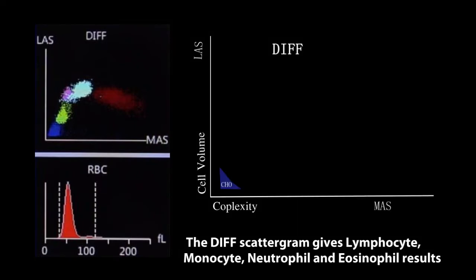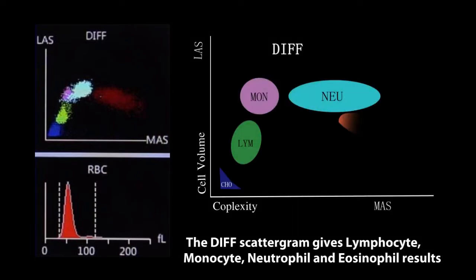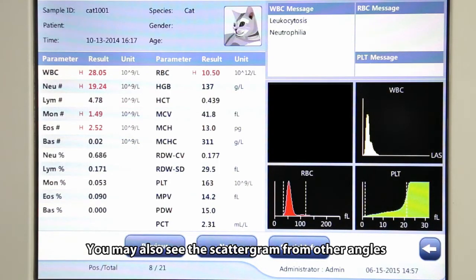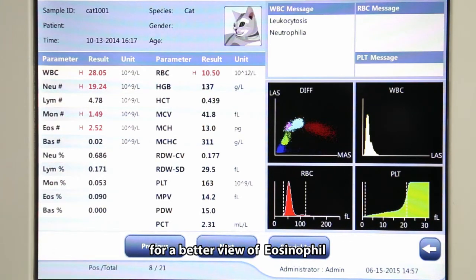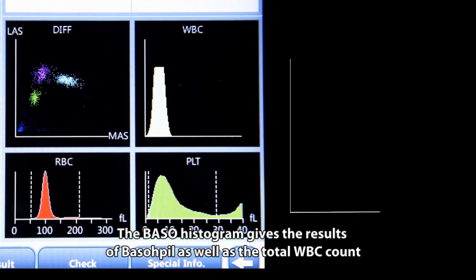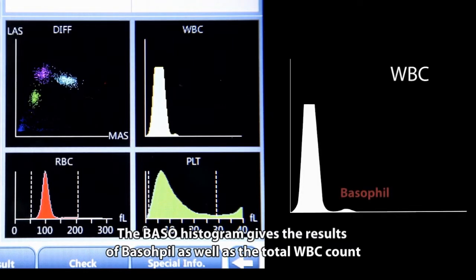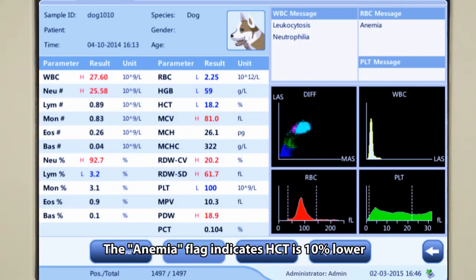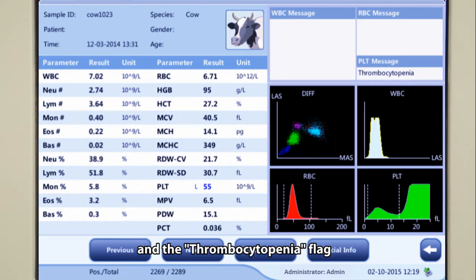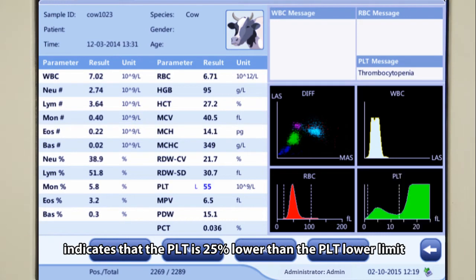The DIF scattergram gives lymphocyte, monocyte, neutrophil, and eosinophil results. You may also see the scattergram from other angles for a better view of eosinophil, which helps better differentiate eosinophil from neutrophil even in high eosinophil samples. The basohistogram gives the results of basophil as well as the total WBC count. The anemia flag indicates HCT is 10% lower than the lower limit of the hematocrit, and the thrombocytopenia flag indicates that the PLT is 25% lower than the PLT lower limit.